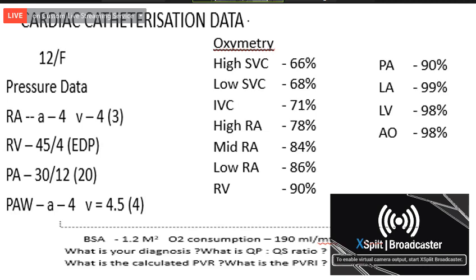Some people have found that in patients with torrential left to right shunt, sometimes the gradient across the pulmonary valve can be as high as 30 to 40 millimeters, and still there may not be any obstruction. So with a very good pulmonary blood flow, a gradient of about 15 millimeters may be because of the increase in the pulmonary blood flow, and by itself may not indicate a separate pulmonary or RV outflow obstruction. Okay, right, go ahead.